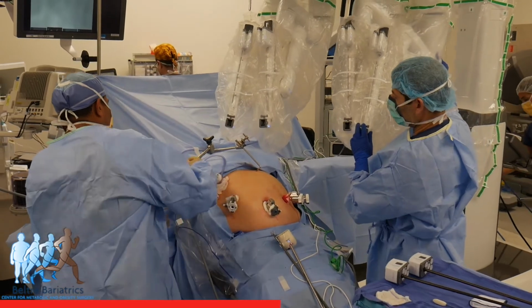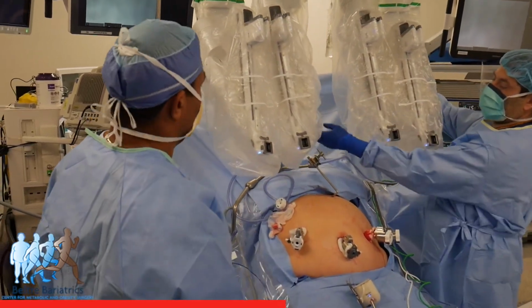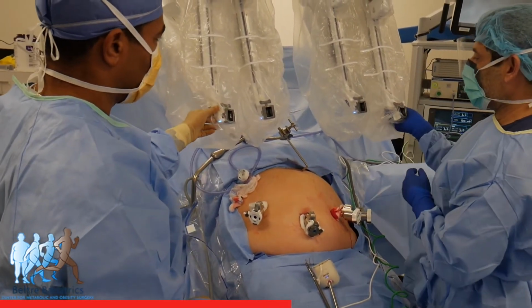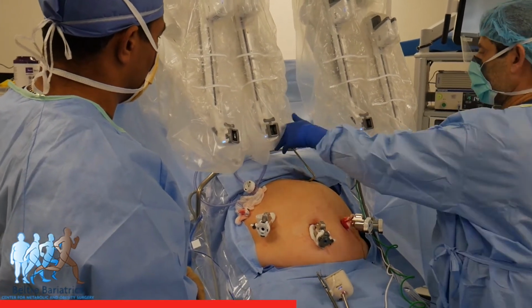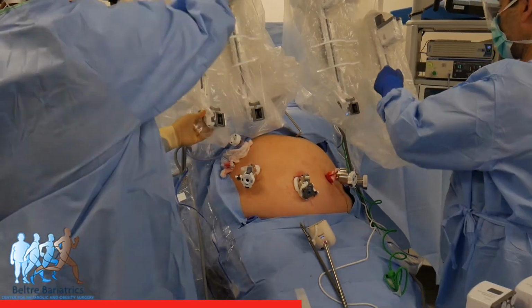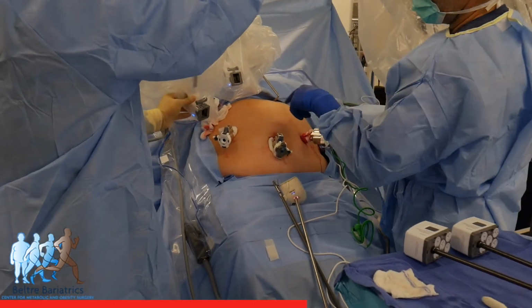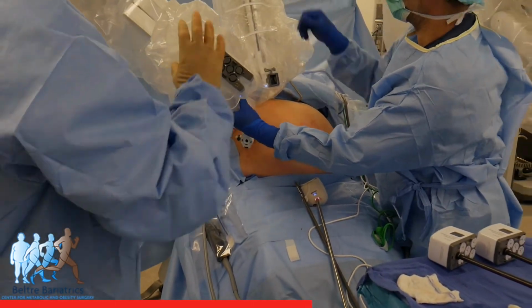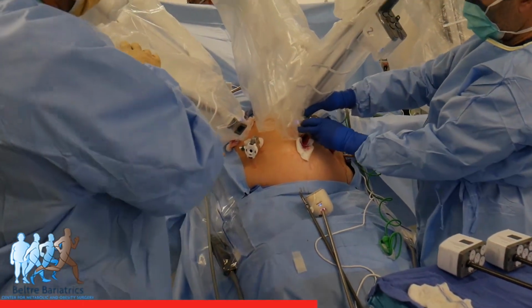Ahí, como pueden ver, el robot estamos dando la vuelta por encima del paciente, y pronto vamos a conectar cada brazo del robot. El robot tiene 4, como pueden ver. Una para la cámara y los otros 3 son para instrumentos para operar. The robot has 4 arms. One is for a camera, and the rest is actually for working instruments, staplers, graspers, things like that, sutures and stuff for suturing.